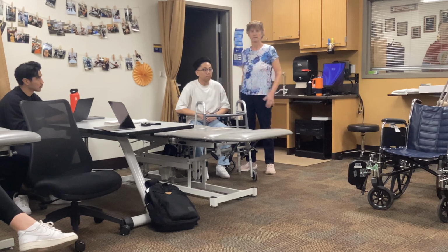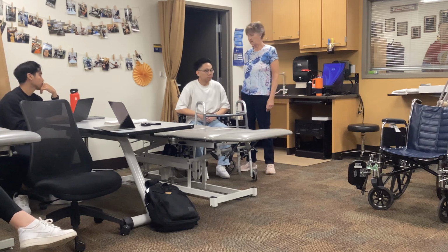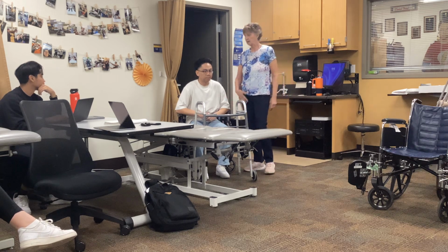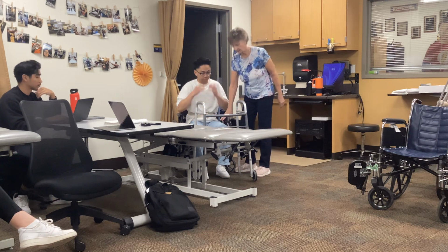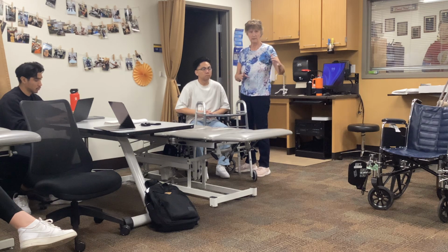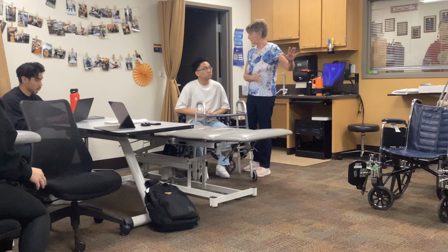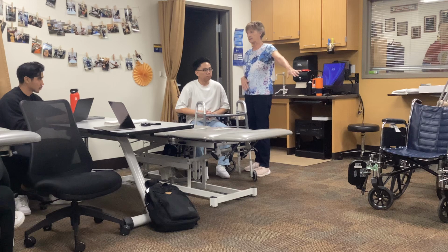I've set him up. Which way do we always transfer toward? The strong side. So his right side is his stronger side. His left side is his weaker side. And now we've got a walker, and we're also going to say that it's non-weight bearing on his left side. All the other parameters still work in there. It's just where the therapist is positioned for the transfer. So it basically looks like how we stood up when we were just looking at gait patterns.